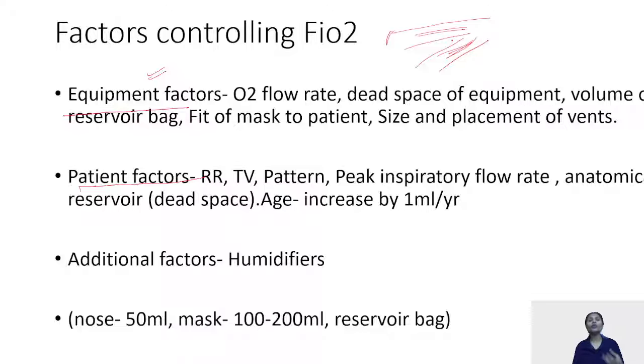Then the volume of the reservoir bag. The reservoir bag volume will decide how much FiO2 the patient will be getting. How fit the mask is to the patient: the lesser the leak, the better the FiO2 being delivered to the patient, because less dilution from the nearby air will be there.